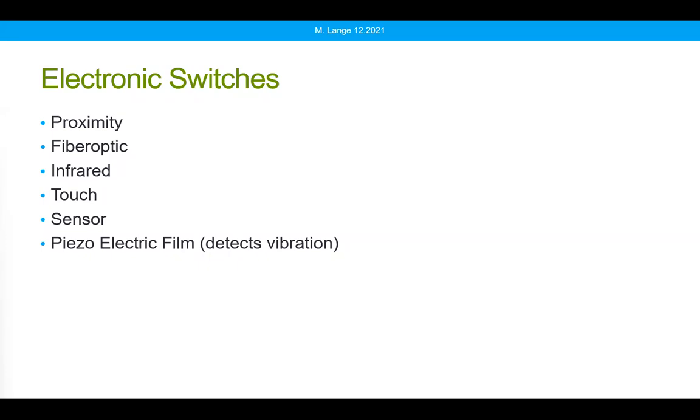I work with a fair amount of clients who have used a switch by a foot and usually learn where it is, just like you and I learn where the gas pedal is in our car, even though we've got a foot that's covered with a sock and a shoe, we still have some tactile feedback. To develop consistency in switch activation, we need to give a client an opportunity to hit that switch hundreds of times to develop that automaticity. So I hope that helps.